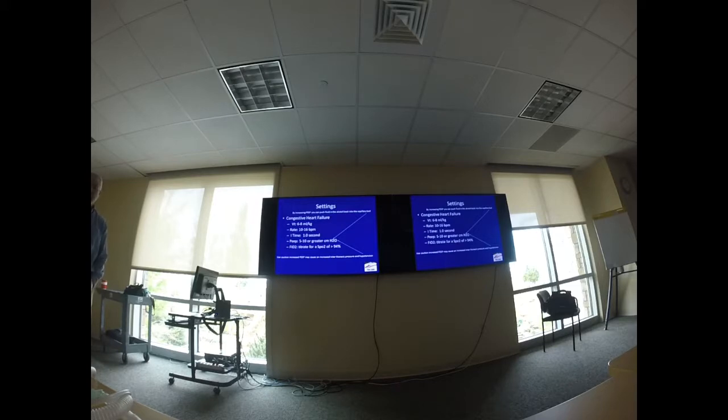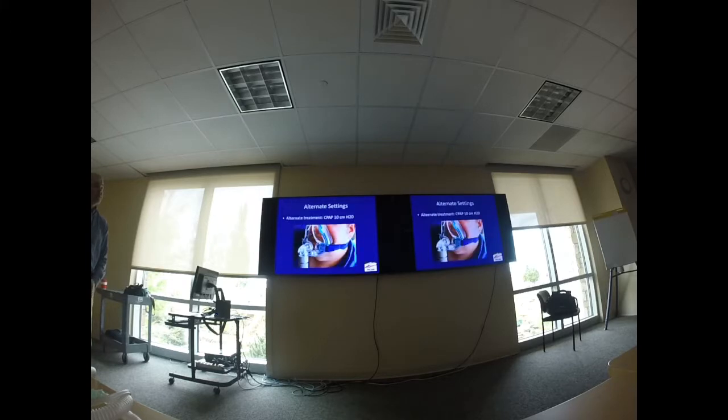I might give them a little bit more PEEP to drive that fluid. Titrate my pulse ox. It's really not anything that different than what you would normally do to anybody. My CPAP, put them on 10. There you go. You guys do these patients all the time.